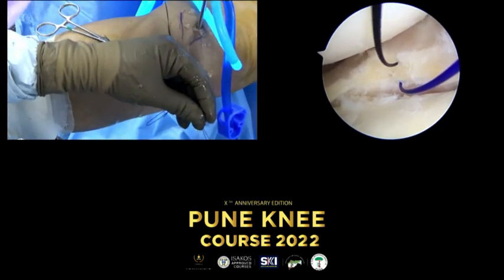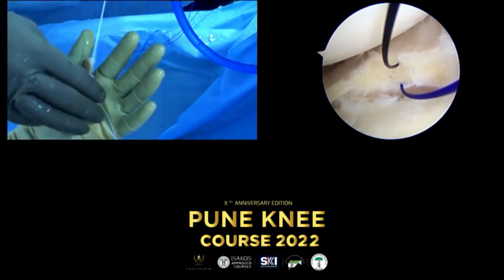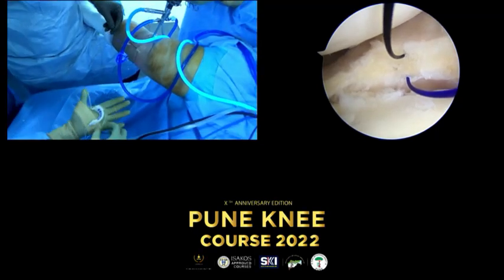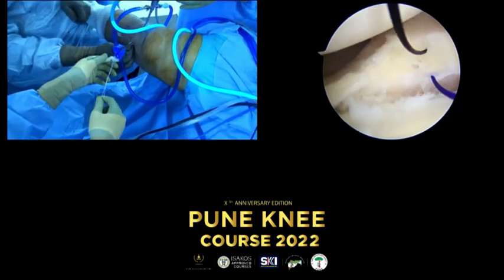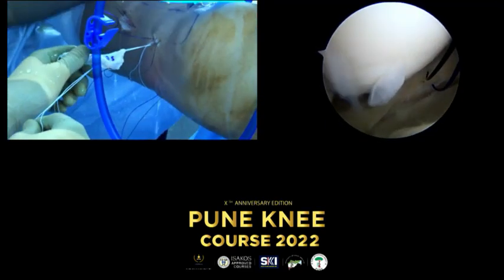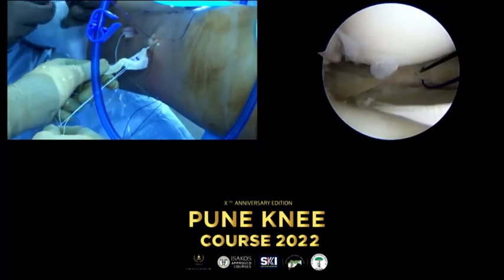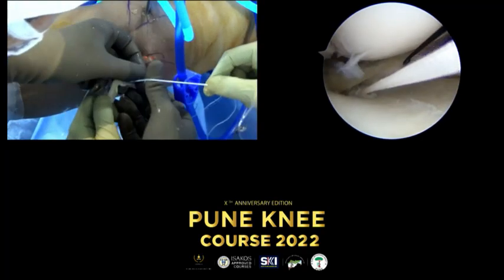So first probably we will go with the posterior root, posterior horn here, just close to me. Yes, this is for me. Can I hold this, please, my friend? Thank you. So the posterior part, close to me, otherwise I don't have enough. Hold it. Why is it not coming? Ah, you're in the middle. Okay, we were around the scope. Now, this is the lower one, the blue. We had to identify it.